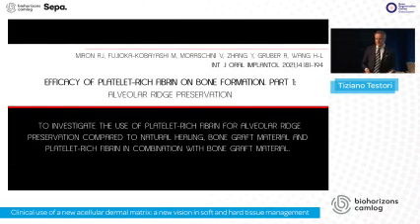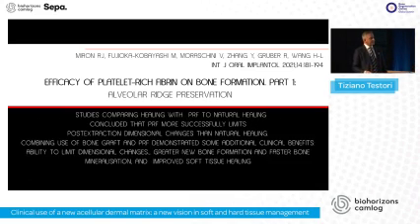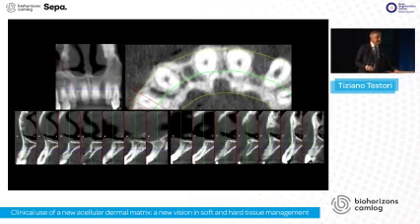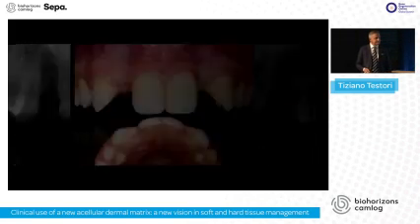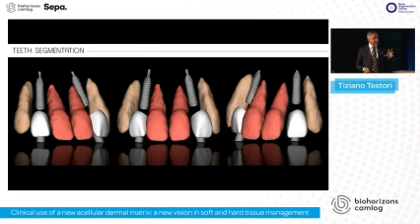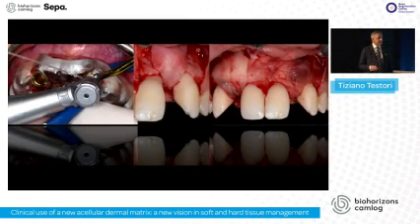This is another piece of information just released comparing PRF, normal bone healing, with graft and PRF. And this is 2 months, 3 months after, 2 months follow-up. Teeth segmentation, because it's a very challenging case in order to do guided bone regeneration.